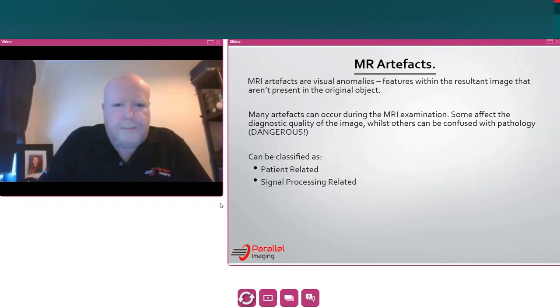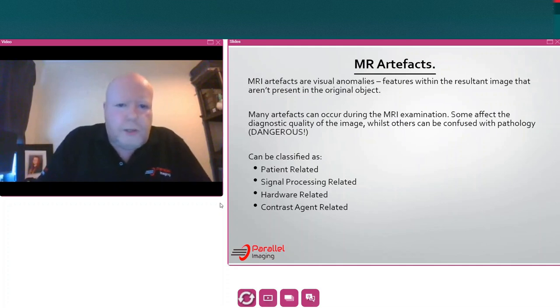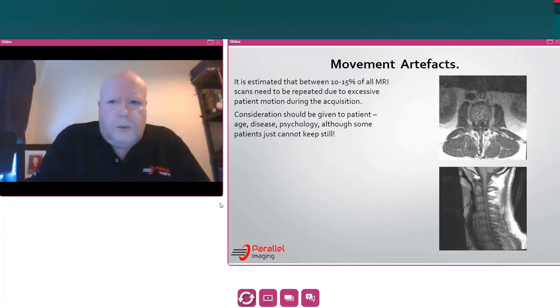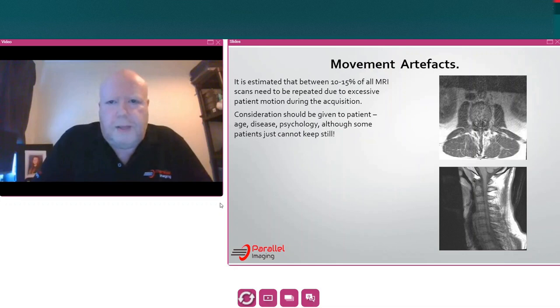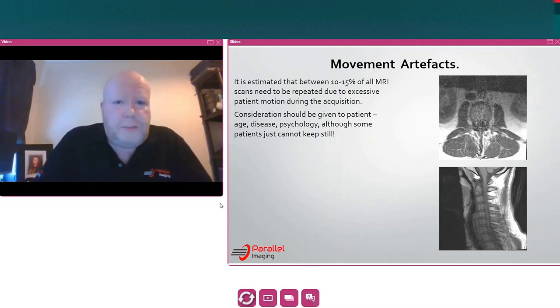The four groups are: patient related, signal processing related, hardware related, and contrast agents related. I'll start with the patient-related artefacts. One of the biggest ones — and I'm sure you've all seen this in your day-to-day work — is an artefact due to patient motion or movement. It's estimated that between 10 and 15 percent of all MR scans need to be repeated due to excessive patient motion during acquisition.